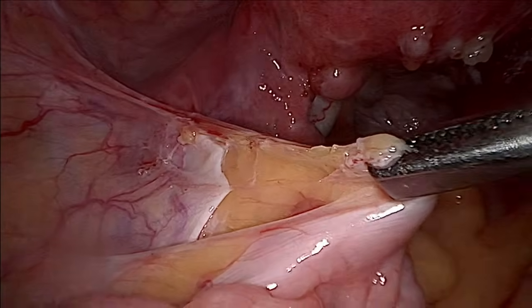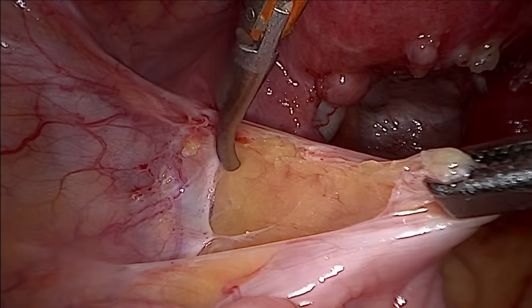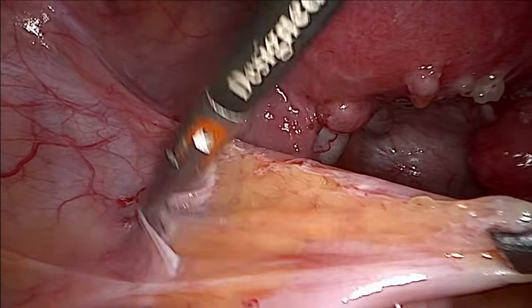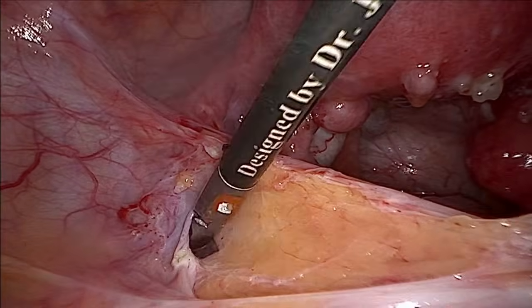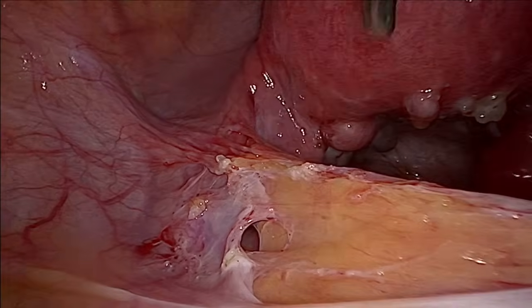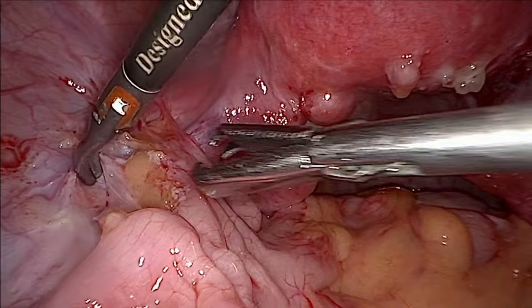You don't need to. I think there is a small smudge on the camera. We will just clean off the camera once I do this additional step. So you can see now this plane, a clear plane here. Stick to this plane.